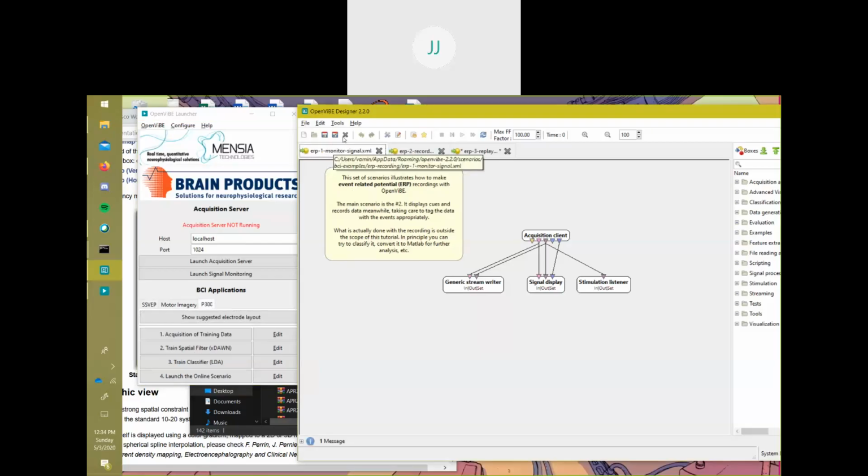So the ERP stuff, it's pretty cool. You can record event-related potentials, possibly. I wasn't able to get this working because in the version I had, the marker plugin wasn't working, which I don't know why it wasn't working on the lab computer, but it is showing up on this one. It's probably the versions. There was also some weird things happening with the versions to get it to run with the ActiChamp.